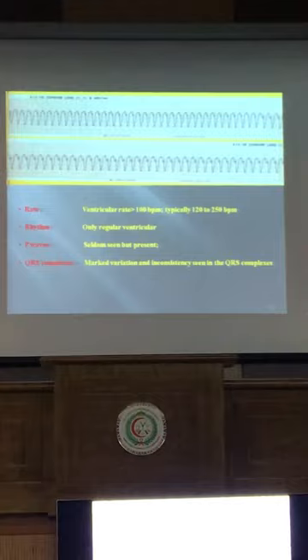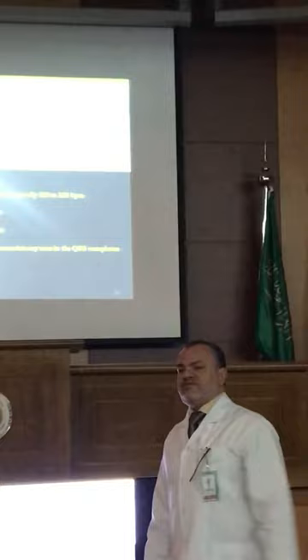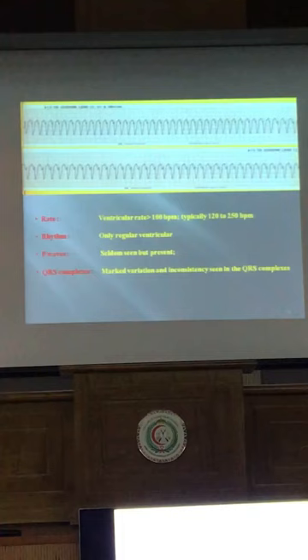V-tach. How is the P here? P is absent. As we mentioned: if P is absent, I will look at the QRS. QRS wide means it is ventricular. If the rhythm is regular, it is V-tach — which is the case here. And this is monomorphic because the QRS has the same morphology. So this is monomorphic V-tach.